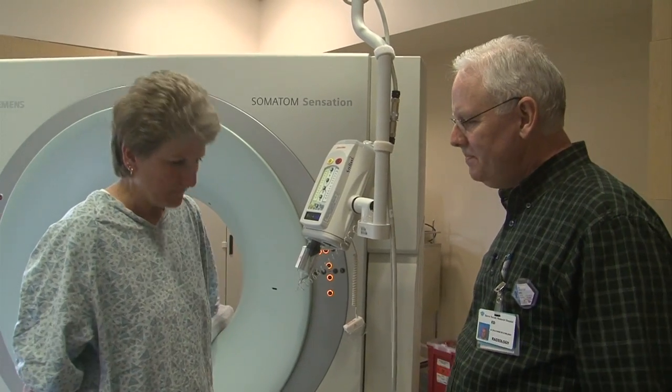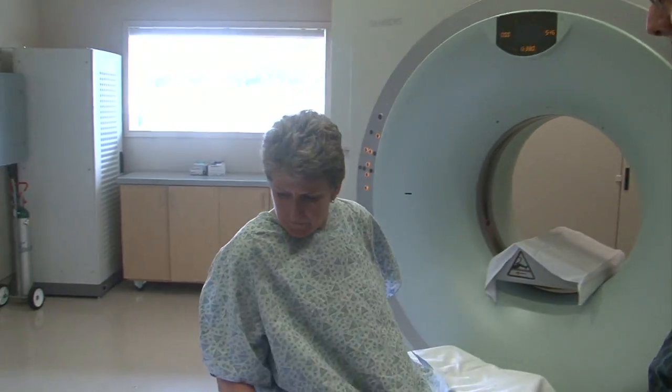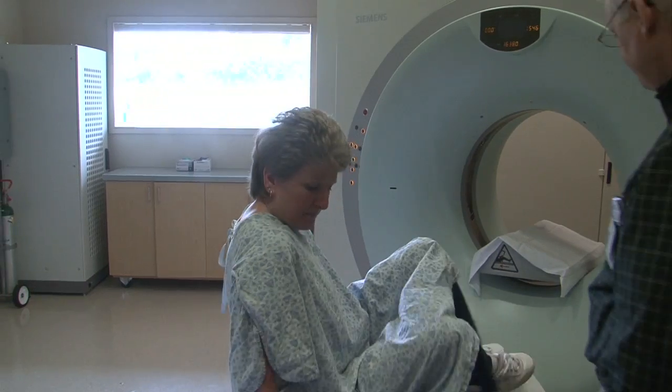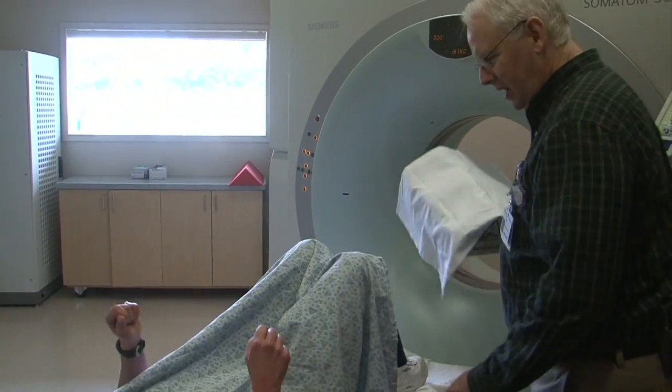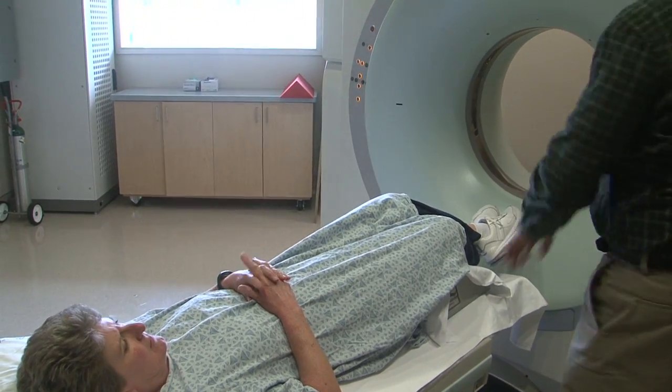So I'm going to have you sit down here and then lay back on your back with your head on the pillow. That's good. I'm going to give you a little cushion under your knees. And then I'll raise this table up.